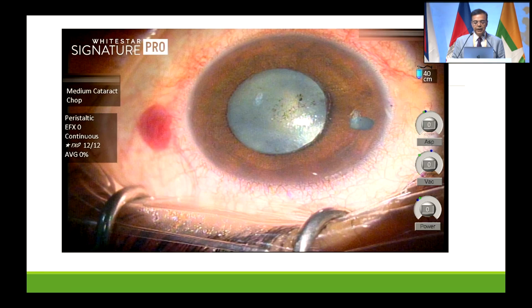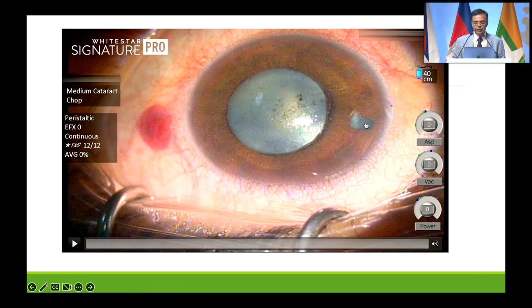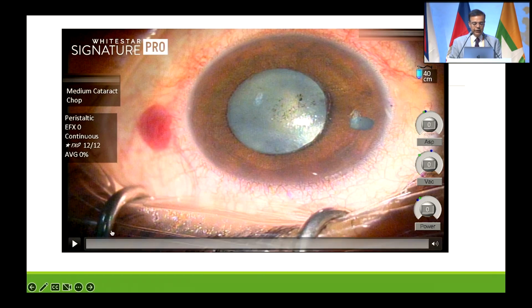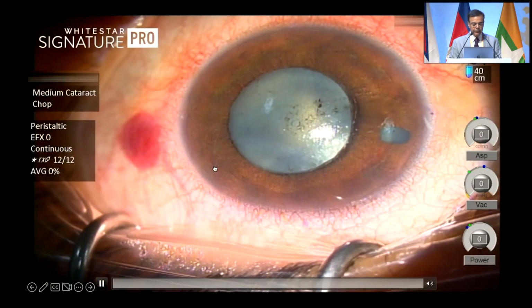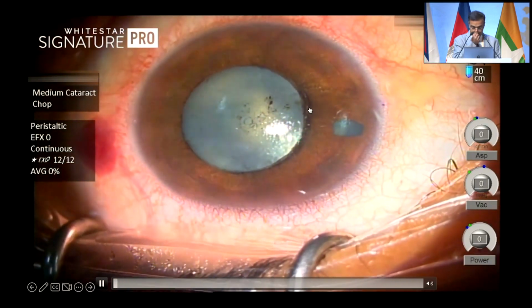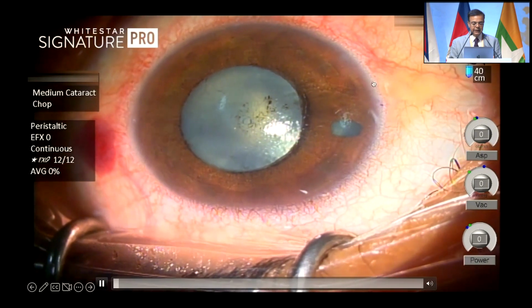Again, we ended up with almost an iris bombé in one eye. So we did a laser iridotomy, which expanded to become quite big. And finally, of course, the inflammation became quiet over a month or 2. Then we took up the patient for surgery, but by this time this lens was very intumescent. So for cataract surgery, there's a pupil which is not going to dilate beyond this. There are some synechiae, and there's an ICL sitting there.